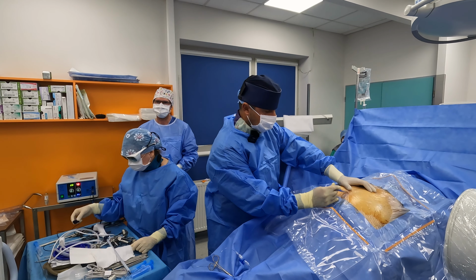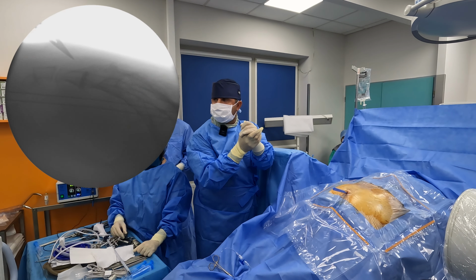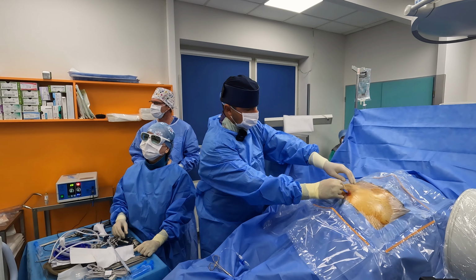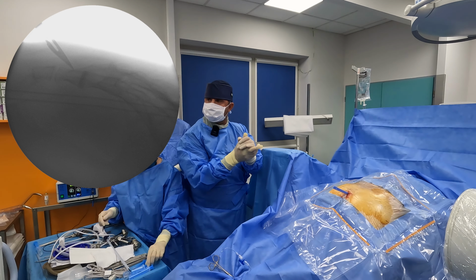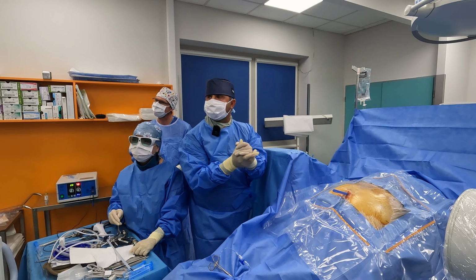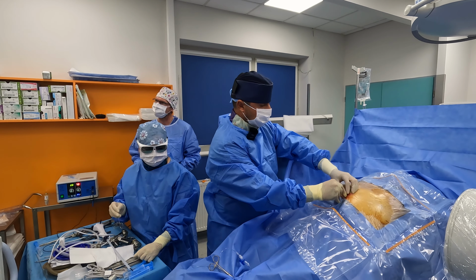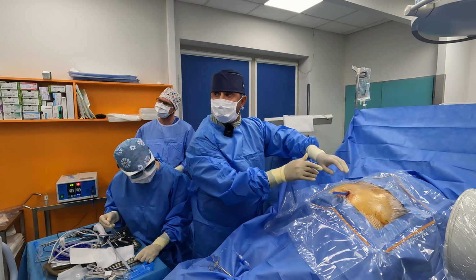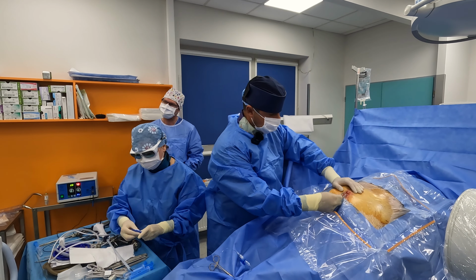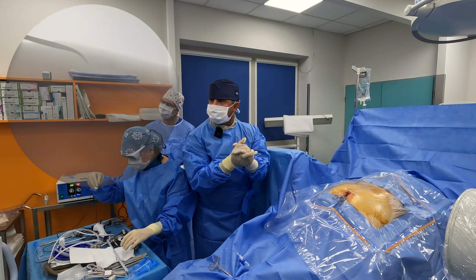So I take a surgical knife and I go the same trajectory as I did before with a needle, and then I'm approaching the sacral canal the same way. Third step, which is the use of surgical forceps to lift up the sacrococcygeal ligament to be able to go inside the sacral canal with the epiduroscope itself. Now I'm taking out the knife, I'm taking the surgical forceps and going inside with that, with the face down of the surgical forceps.